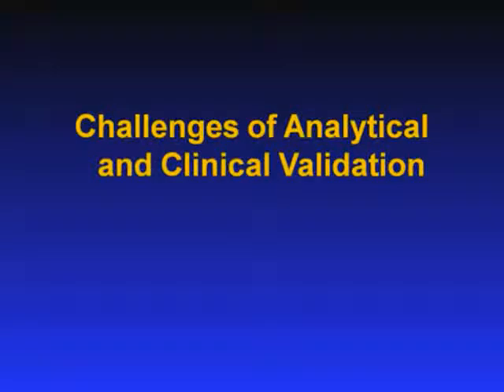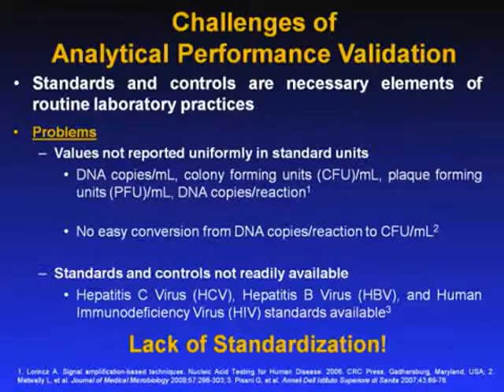This leads us into some potential challenges that will be encountered with both analytical and clinical validation of a novel nucleic acid recognition device. The next two slides will focus on challenges associated with analytical validation. It is well known that standards and controls are a routine part of laboratory practice. However, problems arise when values are not reported in standard units and when standards and controls are not readily available, which unfortunately is the case with most nucleic acid recognition assays.